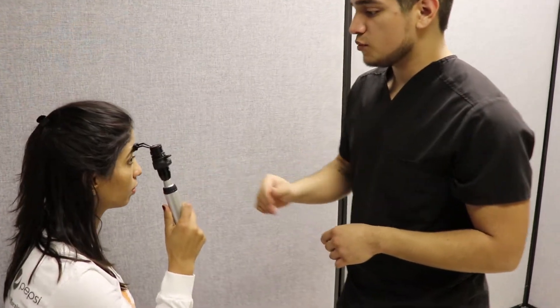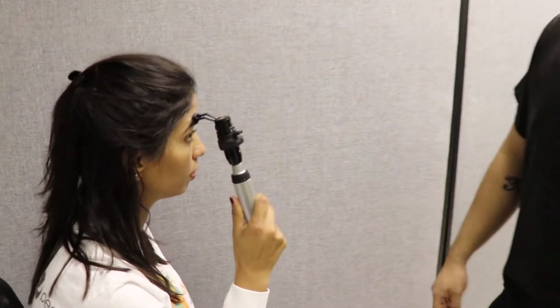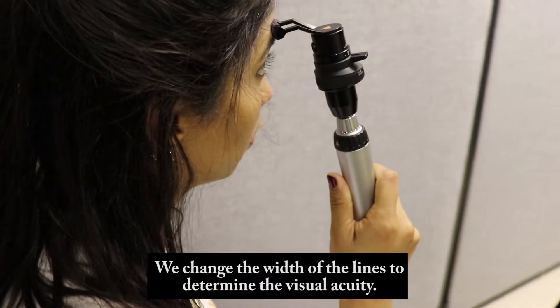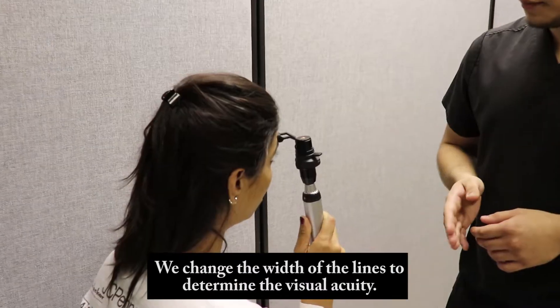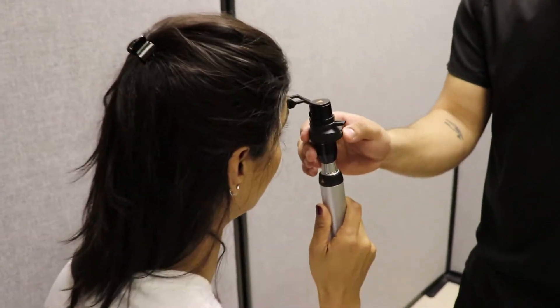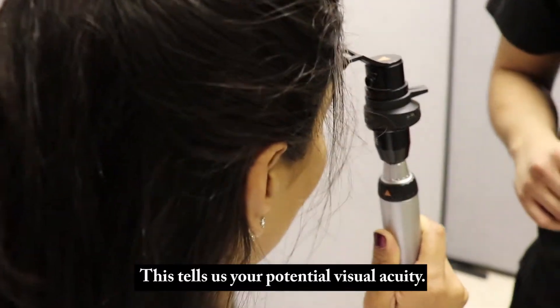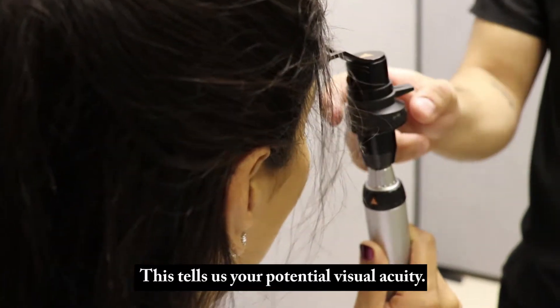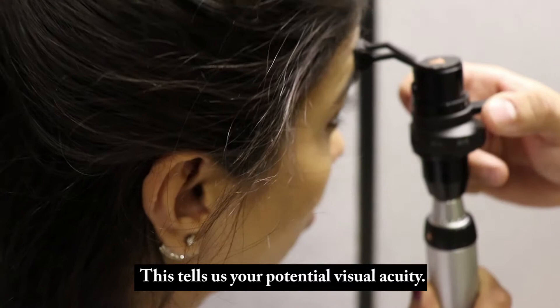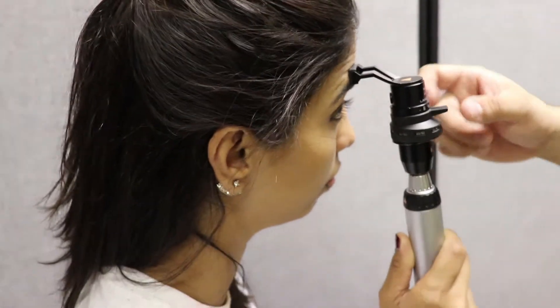Now what you should be seeing is some red lines. Tell me which way they're going. They're vertical. Now it should get a little bit thinner — let me know the direction now. They're horizontal now. And how about here? It looks like a circle.